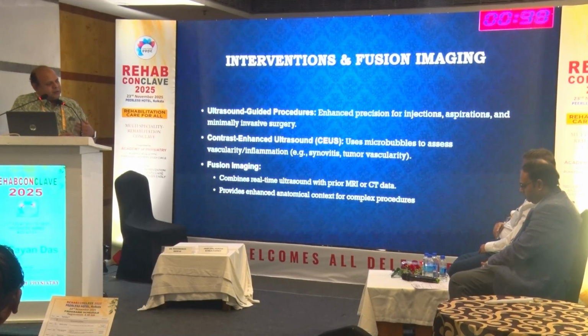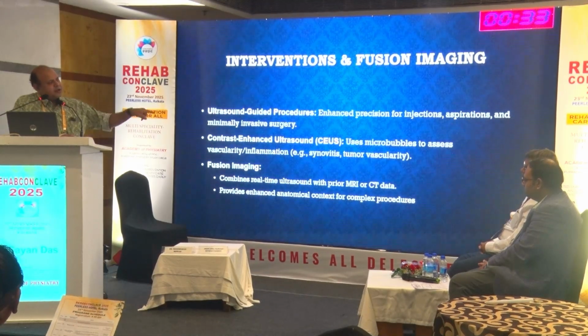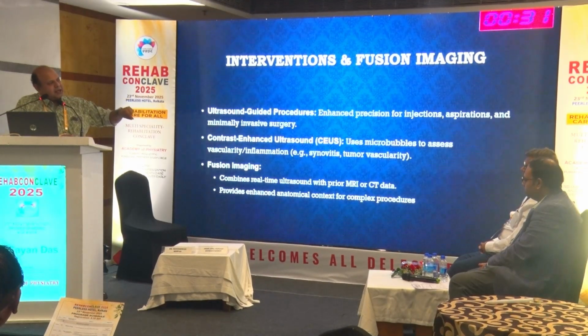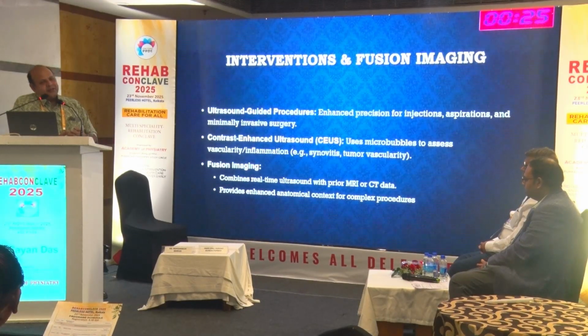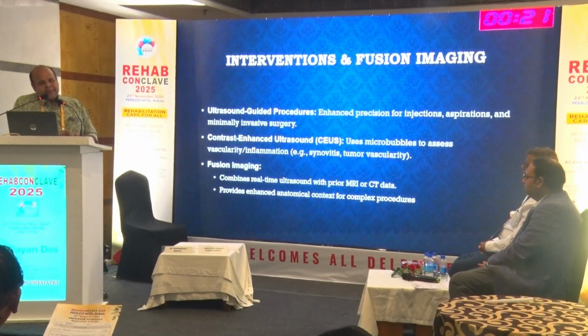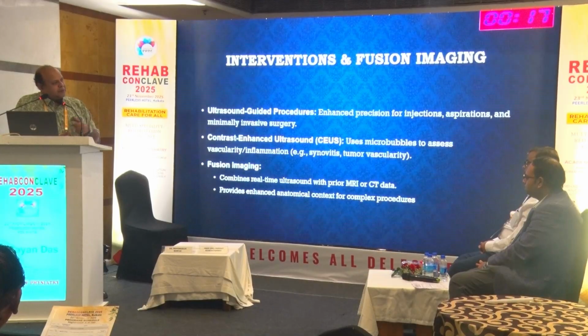Thereafter, you put your ultrasound probe on the shoulder, you are pointing somewhere in the shoulder, and that shows on the MRI which area you are actually pinching on. And after that, you can decide your intervention. Suppose I want to block a suprascapular nerve. Now on ultrasound, I am seeing the groove and I am putting my needle in.